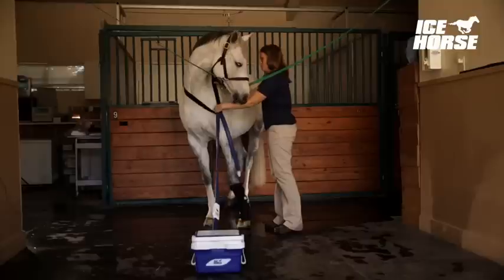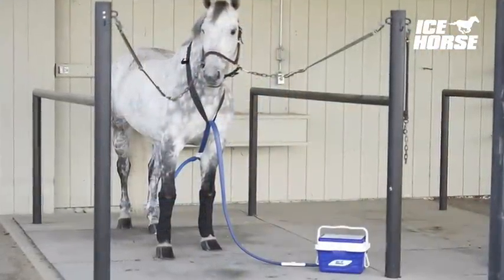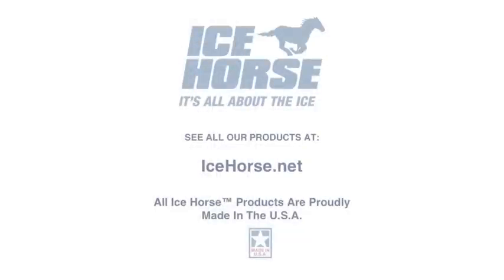For safety, run the cooling hose through the velcro martingale provided. Finally, attach the wraps to the horse's legs and plug in the cooler. Regulate the temperature using the adjustment dial.